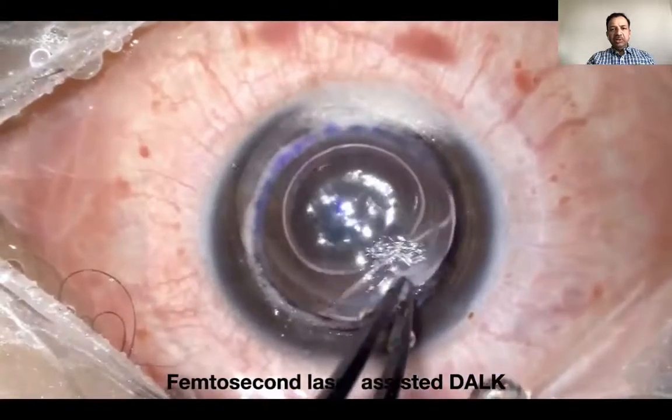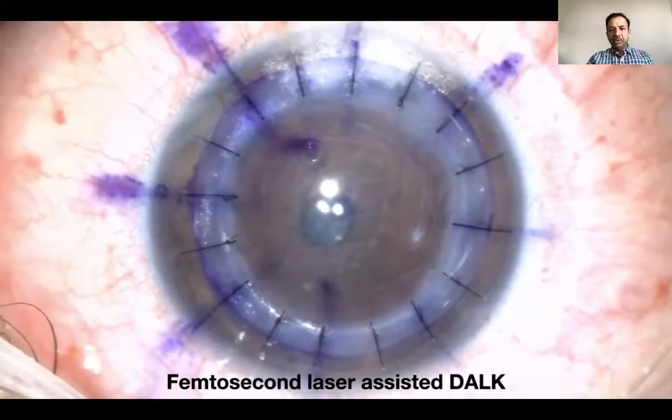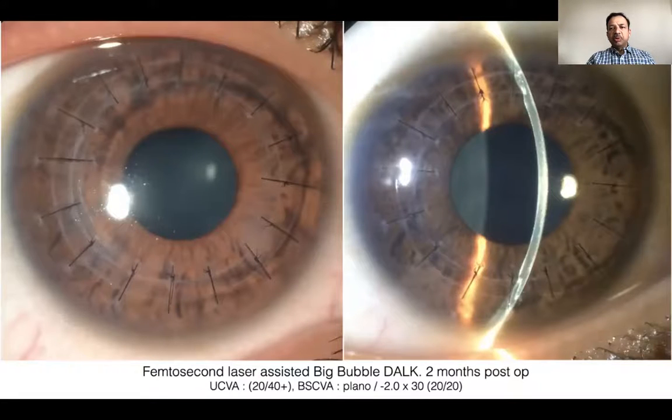With femtosecond laser, you don't need to really oversize. We prefer to use the same size, and this is then secured in position. That's the post-operative outcome, showing you a nice alignment of the donor and the host.